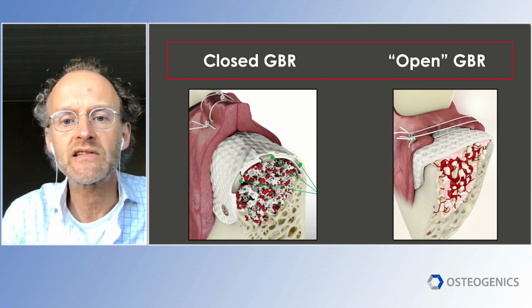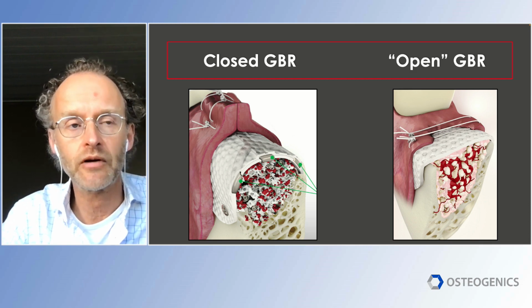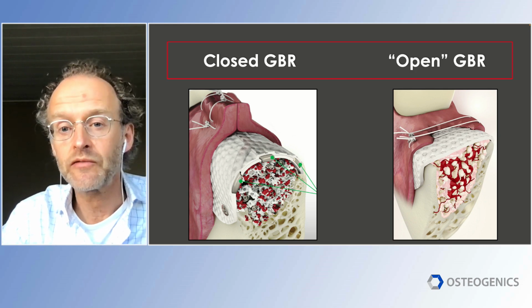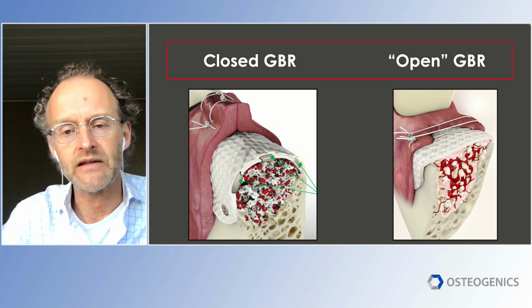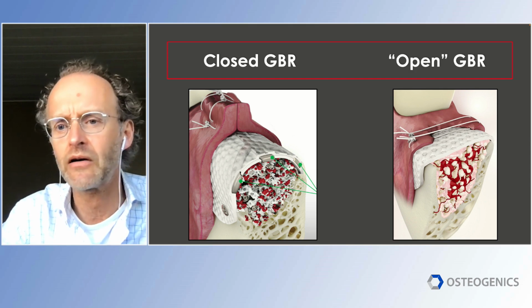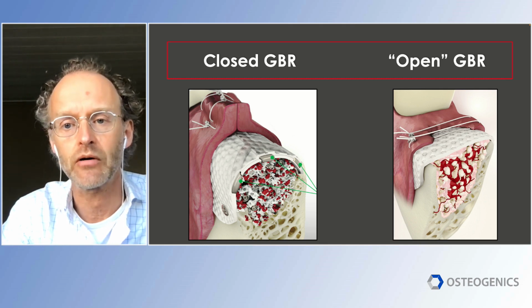So how did we run into this membrane, my colleague Lodewijk Grunemann and myself? Well, I think it was 2008, and we went to an implant congress in Europe. And we picked up a leaflet from the Osteogenics company, or from the booth. And on the plane back, we looked at this leaflet, and we saw a case of Dr. Barry Bartee extracting a tooth and then covering the extraction socket, but leaving the membrane open. And we really looked at each other, and we were wondering, what is this guy doing? He's leaving the membrane exposed, something from our point of view very uncommon, because we all knew and were trained that with the older expanded ePTFE membrane, if you got an exposure, you were in deep trouble.